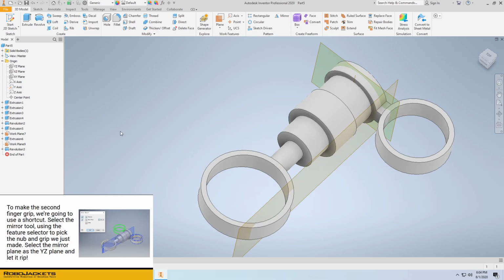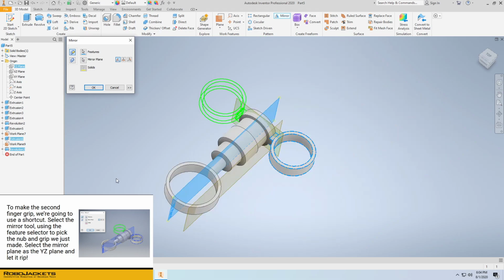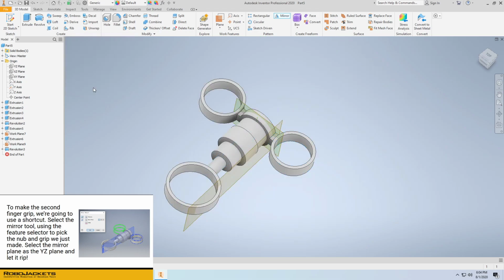We're all about working smarter, not harder. So here, we'll use the mirror tool, selecting our revolution feature, as well as the nub feature, and mirroring it across the YZ plane, we create the other finger holder that we wanted to without having to go through all the different work plane things.